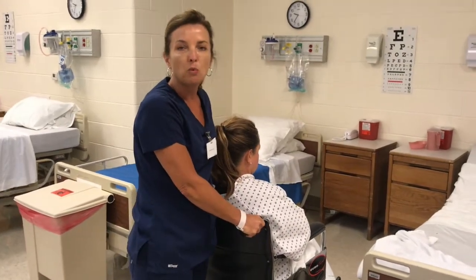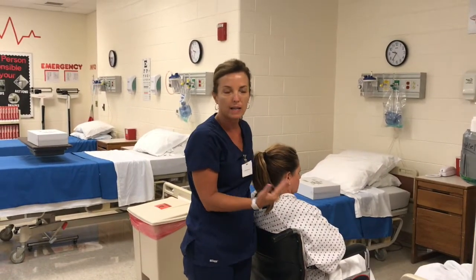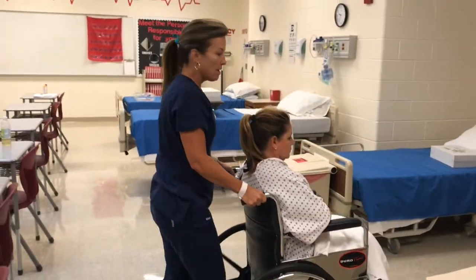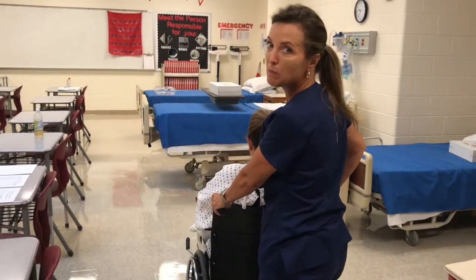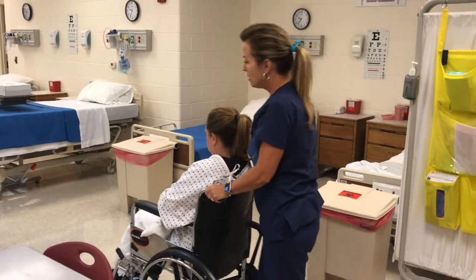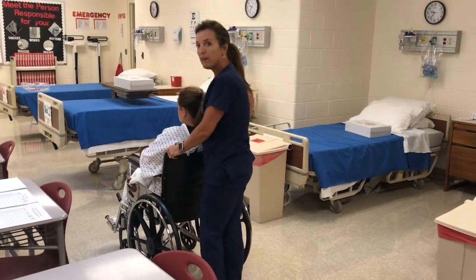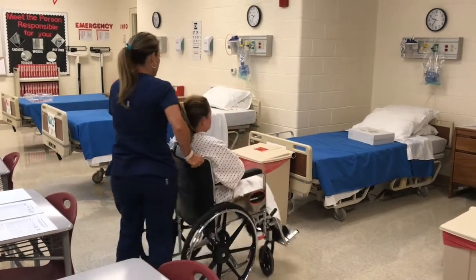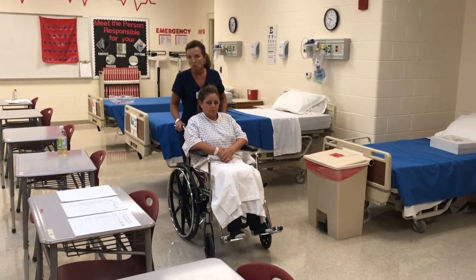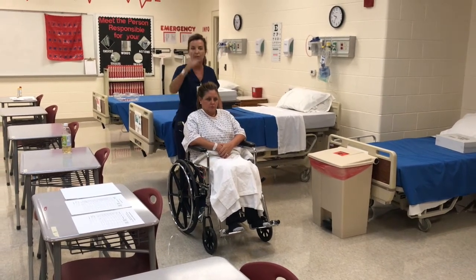To get the wheelchair going, always remember your proper body mechanics. You're going to let your body weight be like a counterweight — get close to the object and then lean back to get it going. When you go down to the elevator, push the button, the elevator doors open, and you're going to turn and back your patient into the elevator. You don't want to push them straight in and have them stare at the wall. Plus it's easier to push straight out when the door opens.